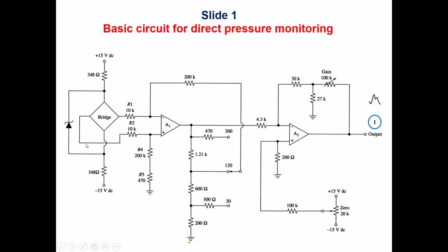So this is the design. As we said, here is a pressure sensor, which is a Wheatstone bridge made up of 4 strain gauges. The output of this bridge will be a differential signal. First of all, any type of pressure sensor needs zeroing. For example, in the case of reading blood pressure, prior to starting the reading you should zero this circuit.